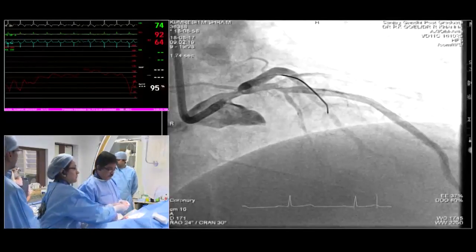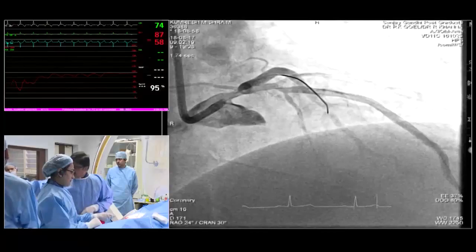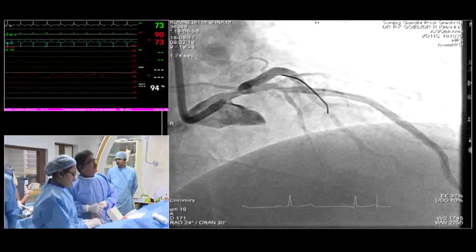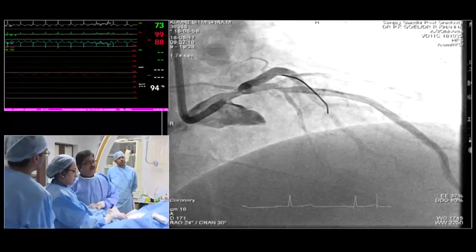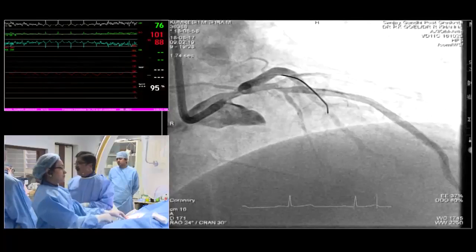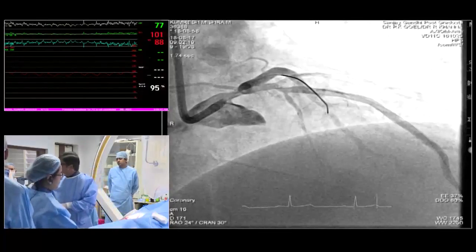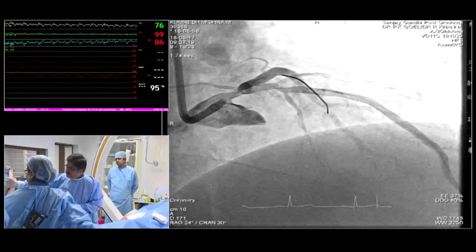to LAD, and if you have an LMCA of less than 8 millimeters, then POT is not possible. I personally feel that you have to cover from the LMCA ostium to the LAD. Otherwise, POT is impossible in this case if you don't cover the ostium, because the LMCA looks like a maximum of 8 millimeter size. I was going to make the same point.